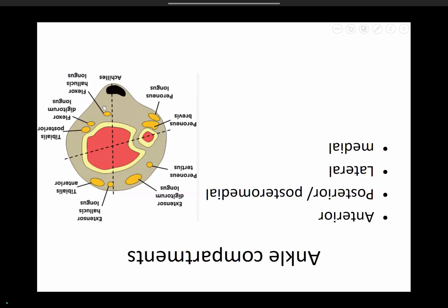Lastly we have the posteromedial compartment — Tom, Dick, and Harry: tibialis posterior, flexor digitorum longus, and flexor hallucis longus. How to remember: TDH in the posteromedial compartment; opposite in the anterior compartment — tibialis anterior, followed by hallucis, followed by digitorum. And 'B for B' — brevis is approximate to the bone of the fibula.